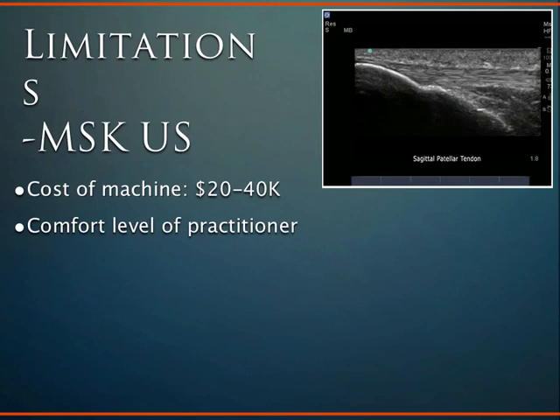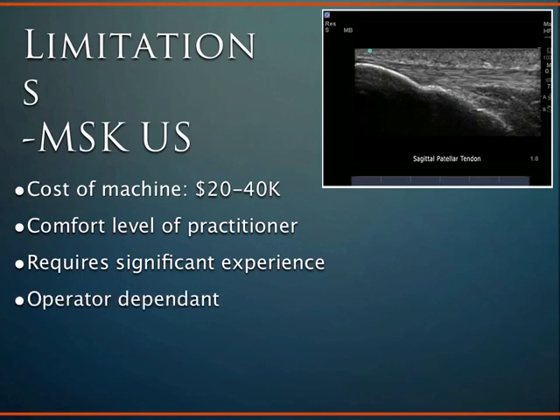Some of the other limitations, as I was alluding to initially, it really is practitioner dependent. If the practitioner isn't quite in control of their anatomy knowledge, or they're not quite experienced with the modality, it requires a lot of time and a lot of investment in terms of extra education. It is something that takes years to get comfortable with. And as I mentioned, I'm still working up to that. So it is very operator dependent.